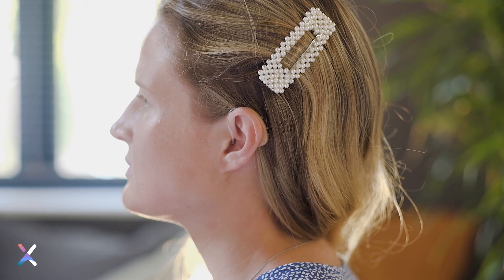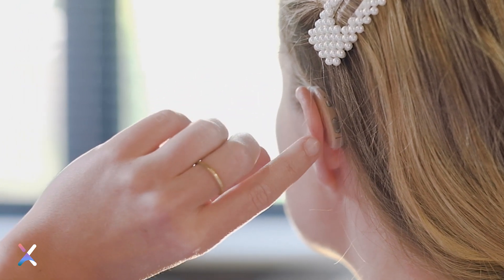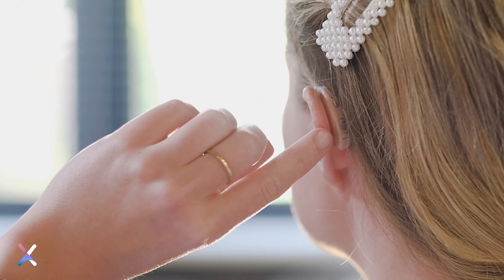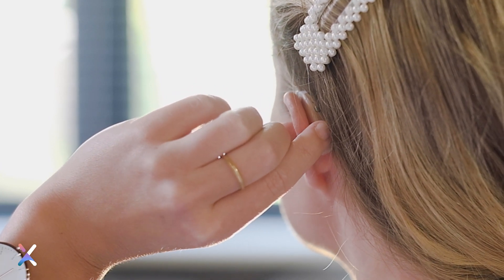Your hearing aid has a long button with an indentation and two points. This is the volume control. Pushing the button upwards will make sounds louder. Pushing the button downwards will make sounds softer.